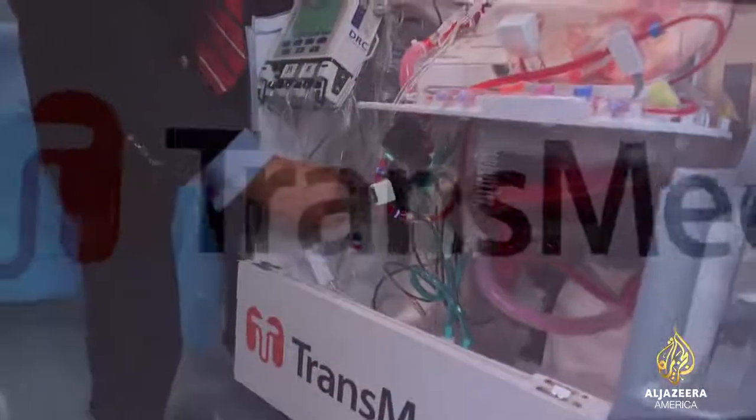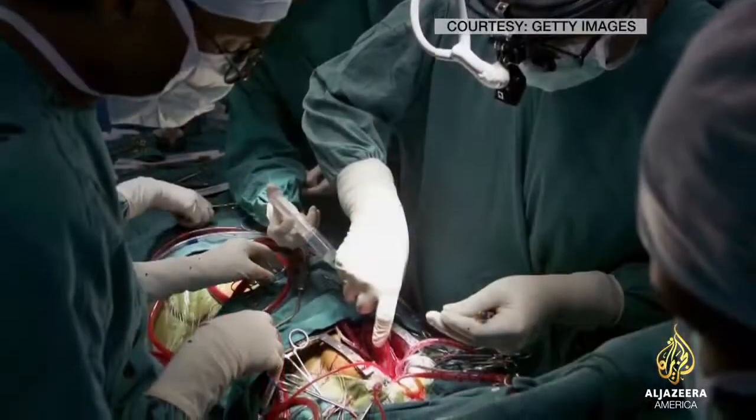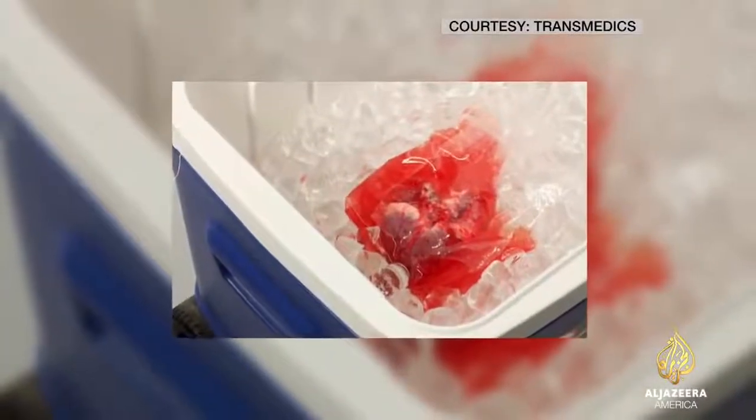Waleed Hassanin is the founder and CEO of Transmedics, the company that came up with the organ care system. His eureka moment came while training to be a cardiac surgeon. The same organ that I'm supposed to be dedicating 10 or 11 years of my life to train how to protect. When it comes to transplant, which is the pinnacle of cardiac surgery, the heart is just thrown in a plastic bag filled and stored on ice. That was the first revelation that there has to be something better.